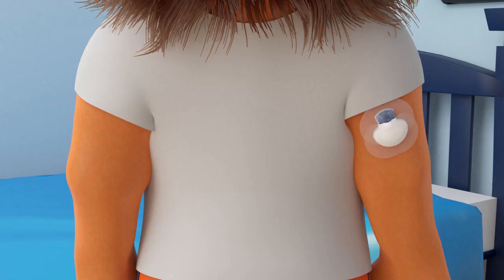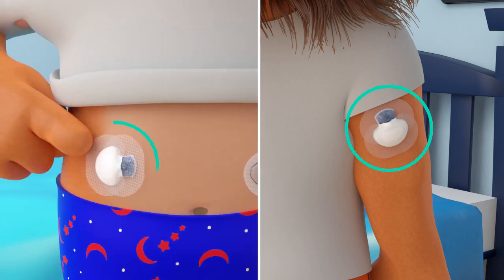You can wear your sensor on the back of your upper arm like Lenny. And depending on which type of sensor you have, you may be able to wear it on different areas.